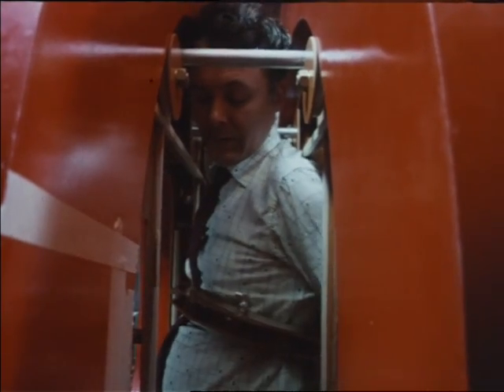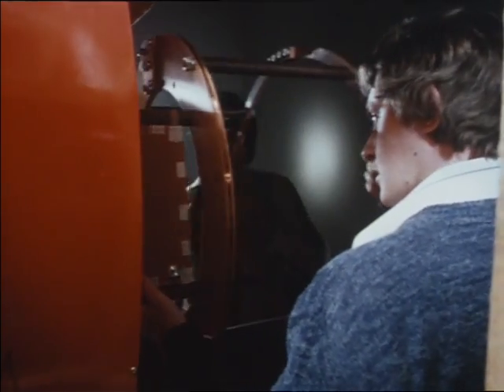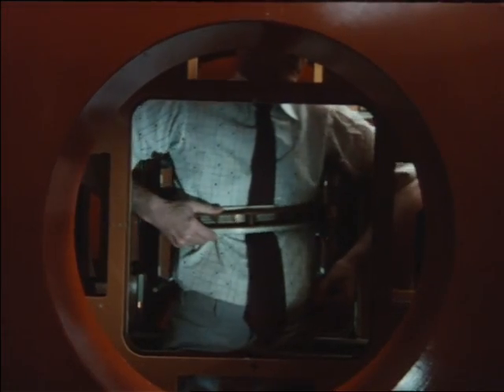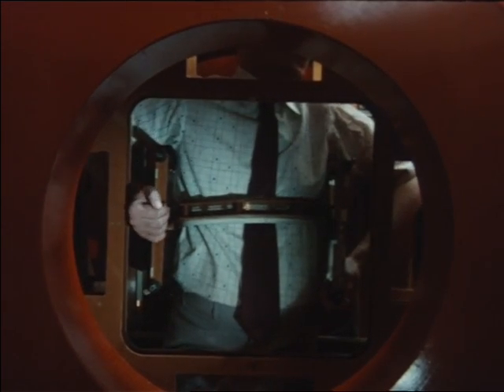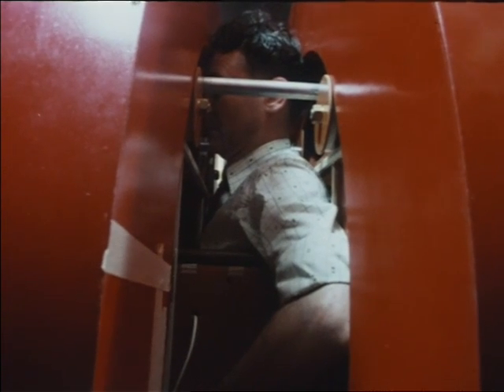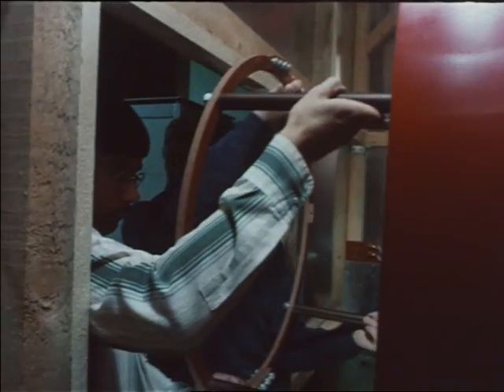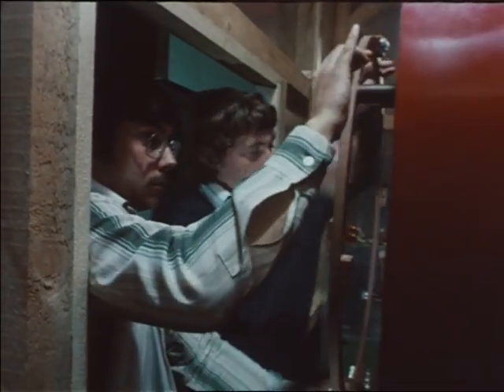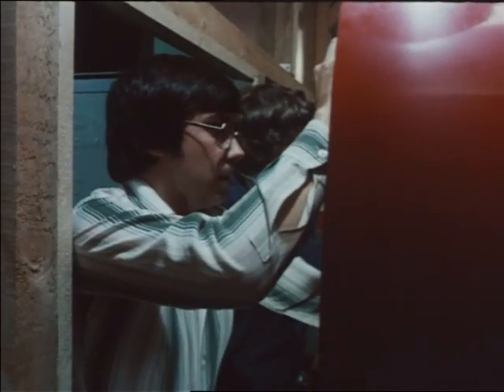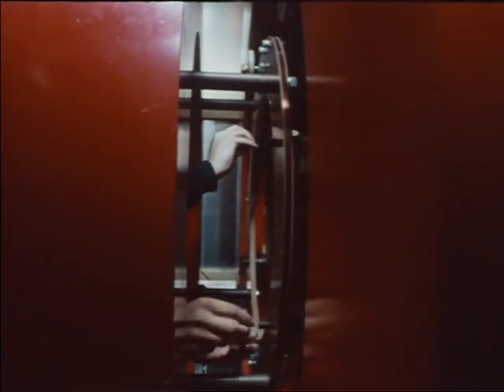Once he's inside the magnet, Dr. Mansfield's assistants fit the coils that will transmit the radio signals into his body. When these experiments were started, it had been suggested by an American scientist that the intensity of the magnetic field could interfere with the heart. However, Mansfield's mathematics disagreed, and he trusted in his own calculations.